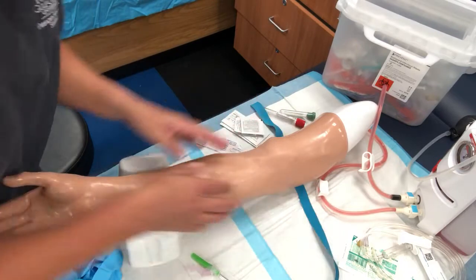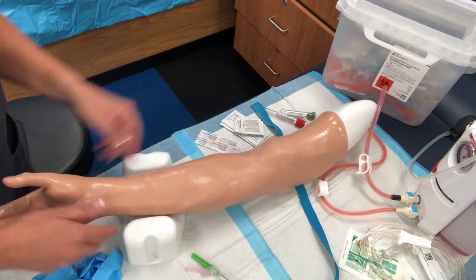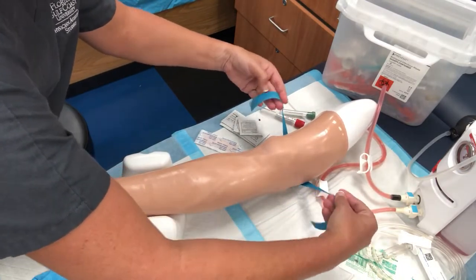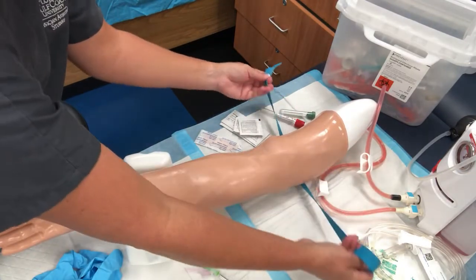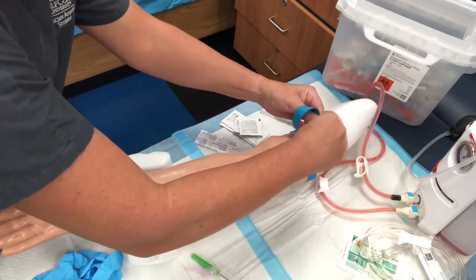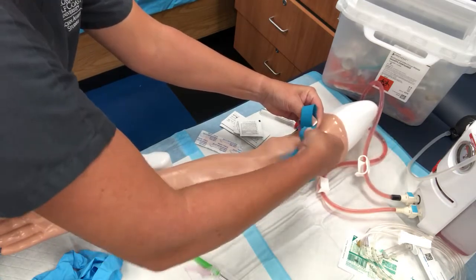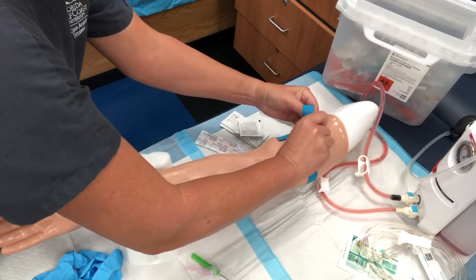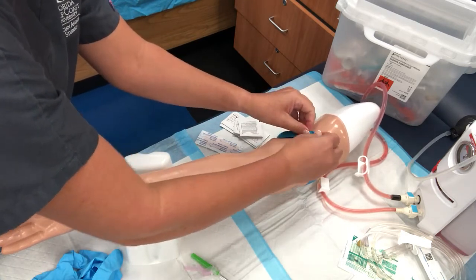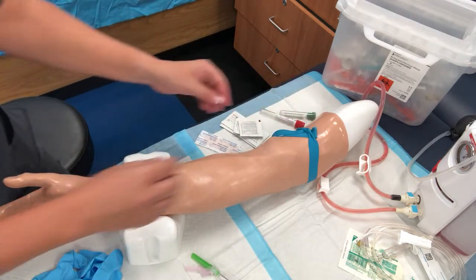So we'll practice this on each other tomorrow because it's kind of difficult on these because of course there's no extra weight to hold it down, but you really want to stretch the tourniquet out. And I'm going to do it without stretching it because it's just me here. Stretch it out. You're going to fold it over, okay? And then you want to essentially just create enough tension and you just want to pop the loop up or down. So if you pop it and you make it up, again, I didn't pull this completely through.